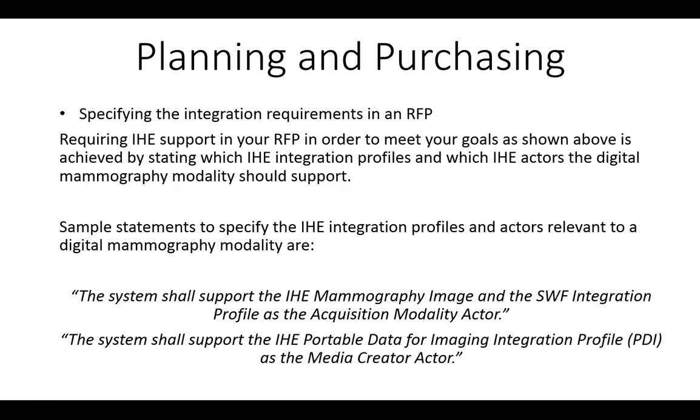For specifying the integration requirements in the RFP, requiring IHE support in your RFP in order to meet your goals as shown above in that table is achieved by stating which IHE integration profiles and which IHE actors the digital mammo modality should support. Sample statements are: the system shall support the IHE mammography image and the SWF integration profile as the acquisition modality actor, or the system shall support the IHE portable data for imaging integration profile PDI as the media creator actor. So those are 2 statements you want to have, and again, for each profile you should have a separate statement in your RFP.